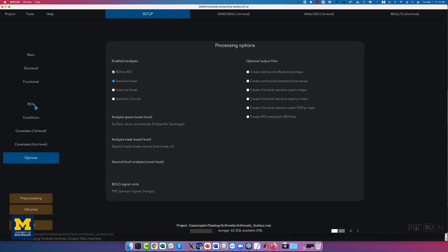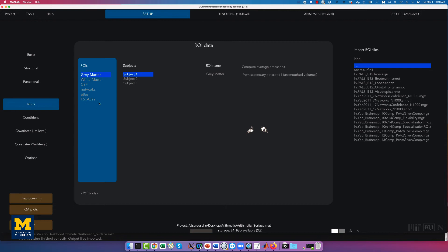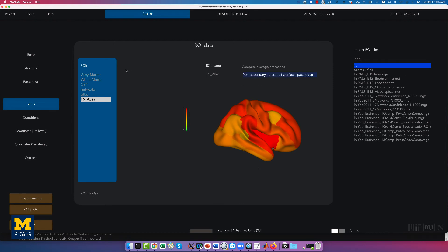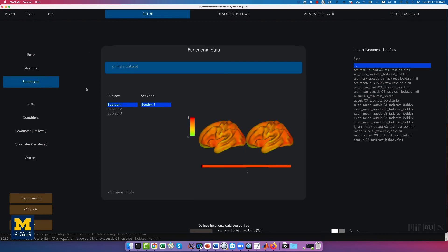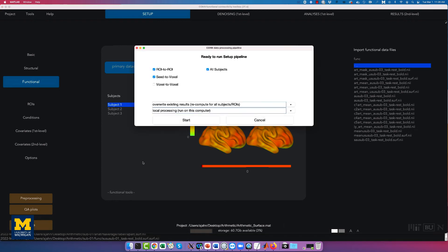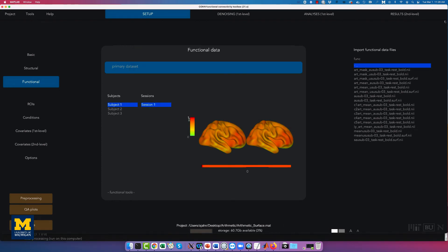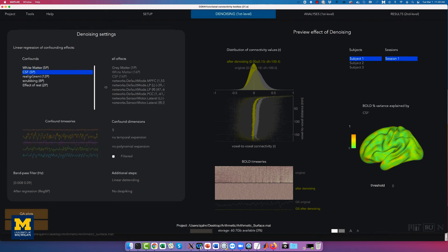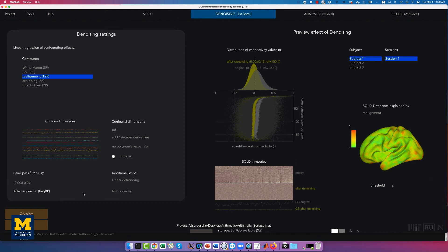When pre-processing finishes, go back to the ROIs section and click on FS Atlas. Under 'compute average time series', select from secondary data set number four — surface space data. This will use the average time series from the resampled gray matter on the surface instead of the volumetric data. You can also take a brief look at the functional data sets now that they have been resampled to the surface, viewing from different angles. When finished, click the done button to run the setup pipeline.